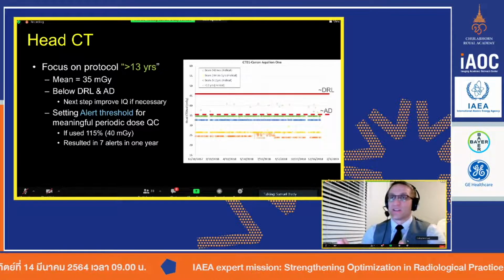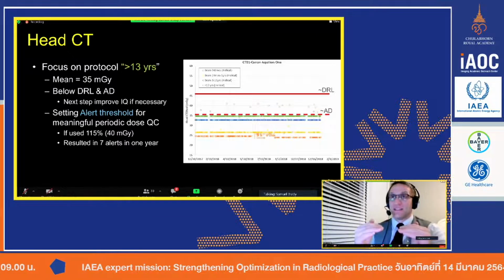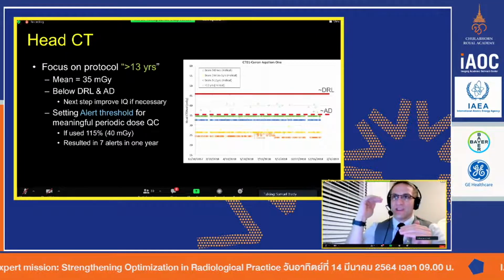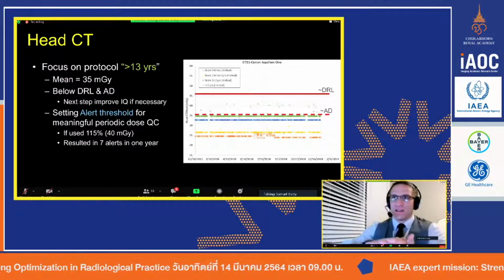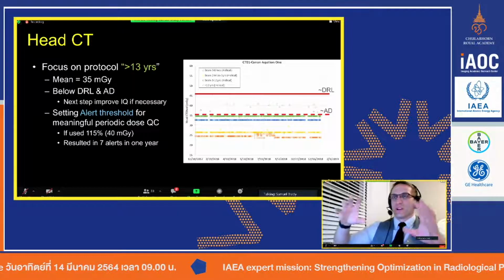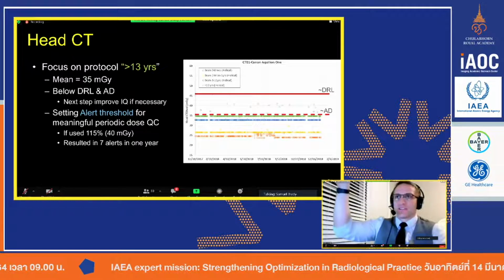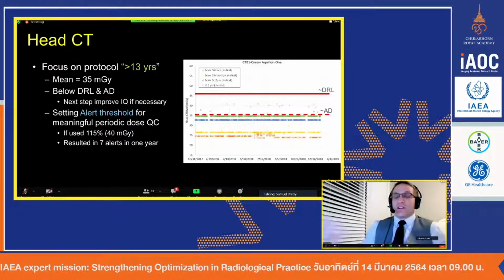But let's be honest here. You already know about it because we have alert levels at the CT scanner. And on the CT, you're not going to get that high unless you had to make a decision. What happens when the patient gets on, you scan them, and something went wrong with the contrast? There's an extravasation. We had this happen when the contrast squirted out of the contrast injector instead of into the patient. We scanned the patient, so contrast didn't go right.